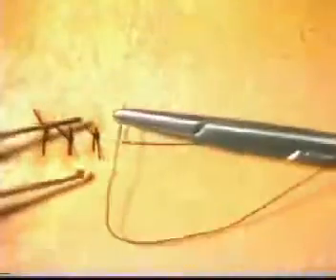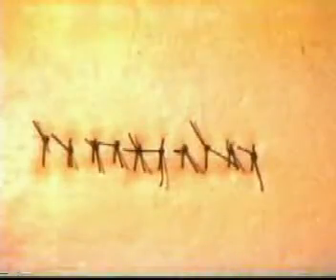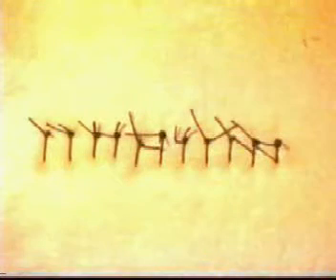Once again, tie a reef knot. Tie your knot, making sure that it lies correctly without any tension. Once the wound is closed, ensure that none of the knots lie over the suture line.